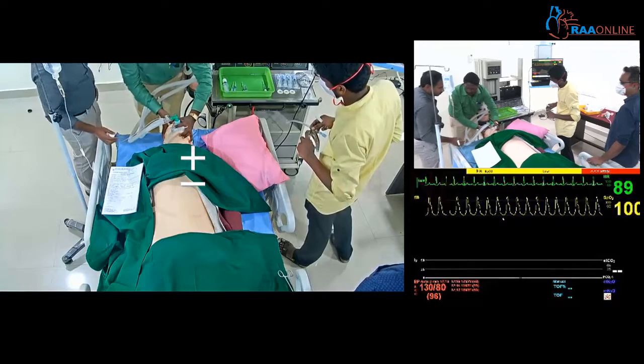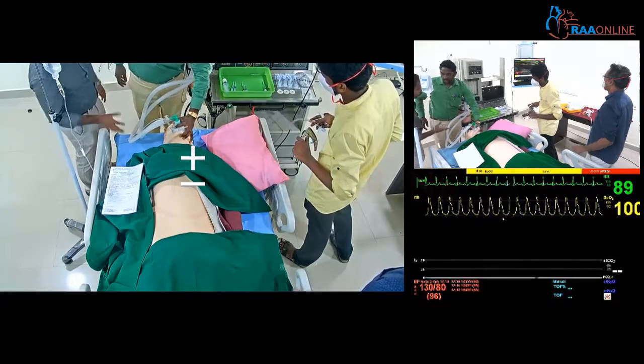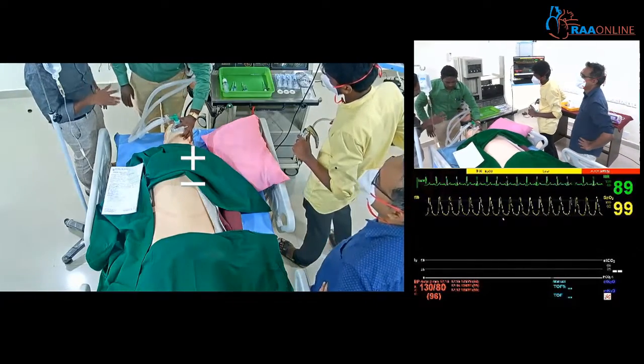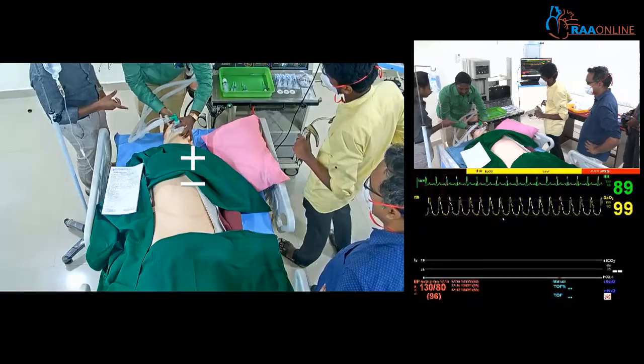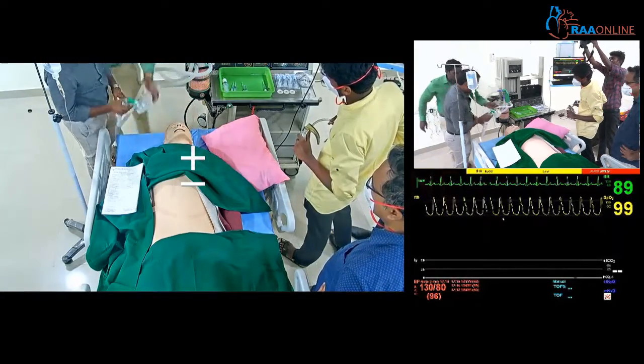Okay. So what I will do is, I will have one try. Okay, sir. I will see what is going on with the airway. So, what is the CL grading? Can you say any CL grading? Cormack-Lehane grading, it's 3A, sir. Okay, sir.